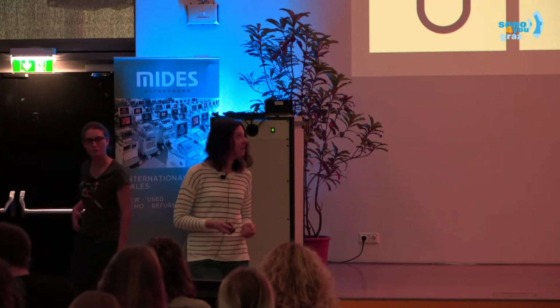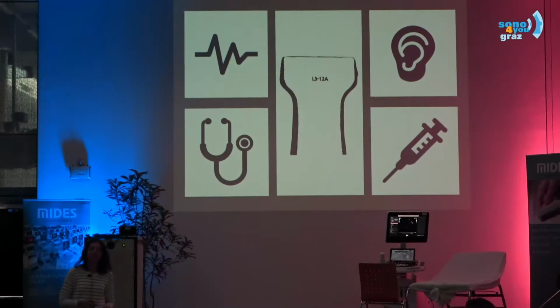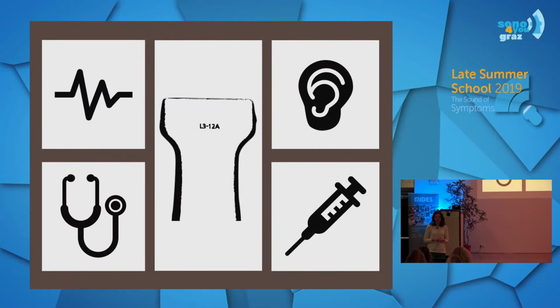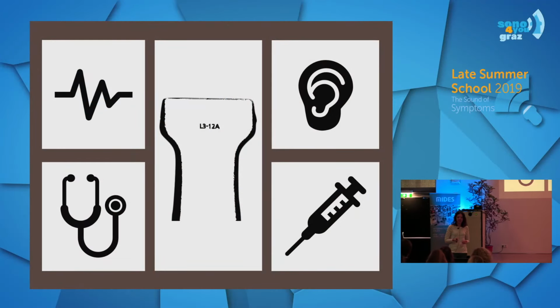So, as I told you before, I will tell you the clinical history of the patient, some details about his examination, his vitals, and if necessary, some lab results. And afterwards, I'll show you some video sequences of the ultrasound examination, and then you'll tell me the diagnosis.